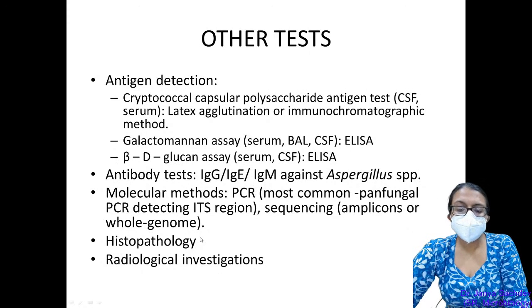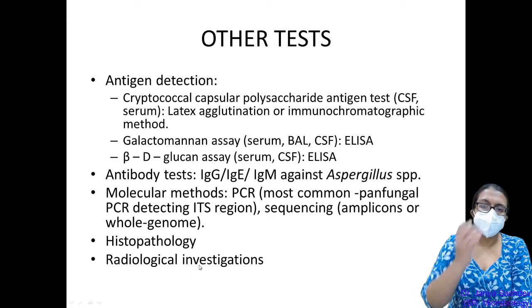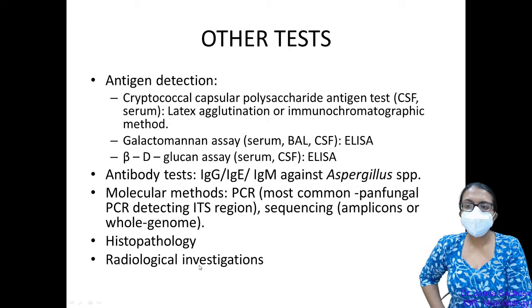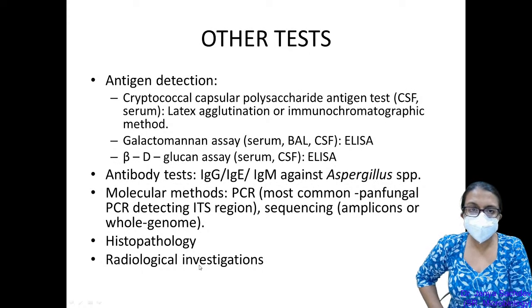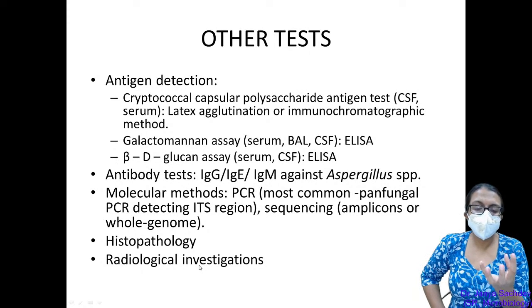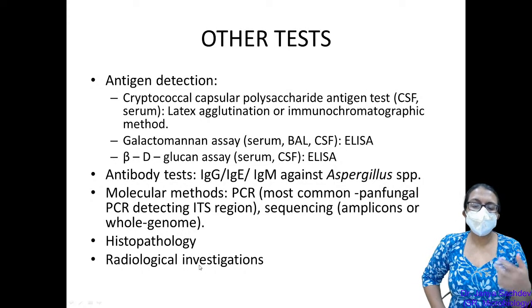There are also roles for other departments in diagnosis of fungal infections. For example, histopathology plays an important role, because they have a variety of other stains. They can also look for tissue infiltrate or inflammatory response in their thin sections of tissue and in their staining methods.